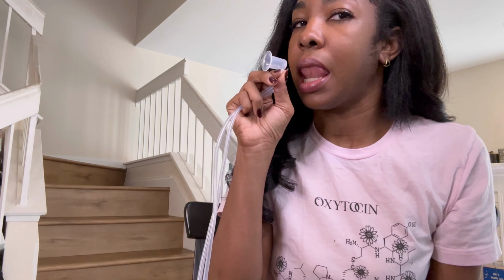And then to clean it, it's pretty simple. This part is not waterproof. This tubing cannot be cleaned with water in it because the water in the tubing will not be able to get out. It will create a mold buildup, and that won't be good. It can also go back into the motor and damage the motor. So you could probably take a Lysol wipe and wipe down this little unit just for cleanliness and sanitary purposes.